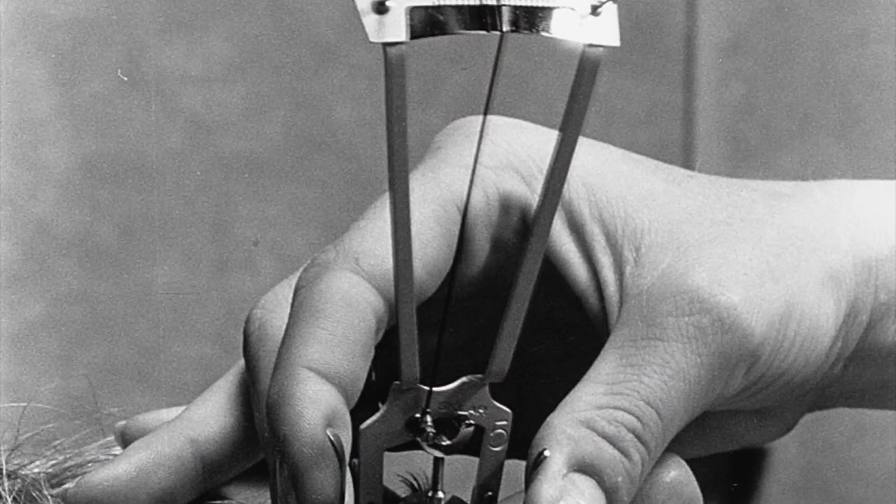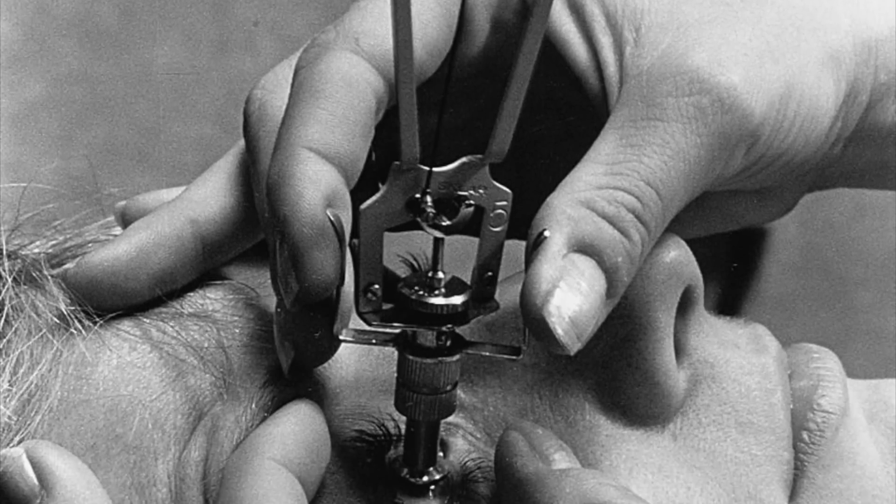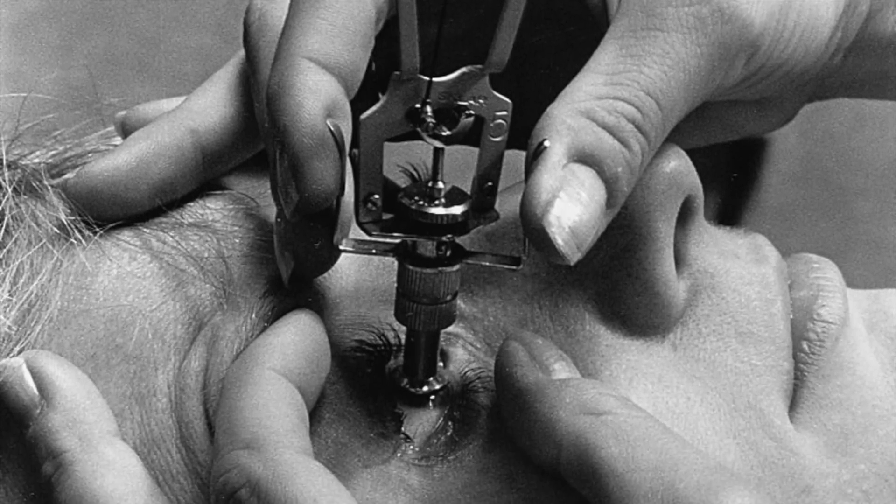This is a Schiotz tonometer, which is used for measuring intraocular pressure or IOP — the pressure inside the eyeball. IOP is a key measurement in the diagnosis of glaucoma, a condition in which the aqueous humor inside the eye fails to drain properly, leading to an increase in pressure and potentially damage to the optic nerve and vision loss.